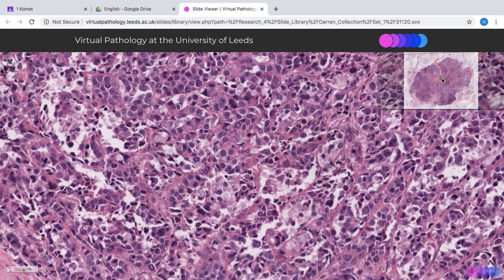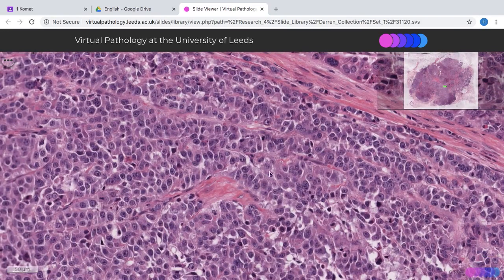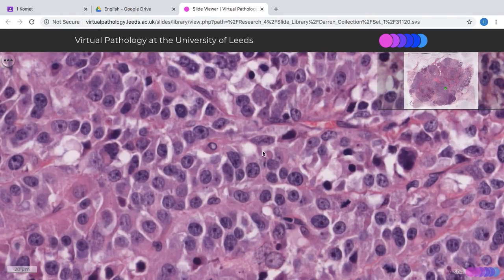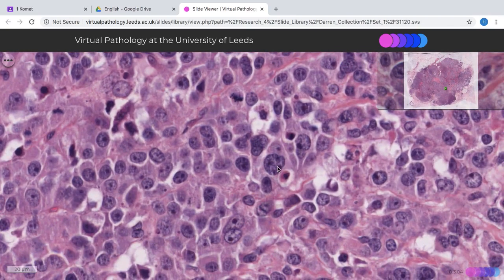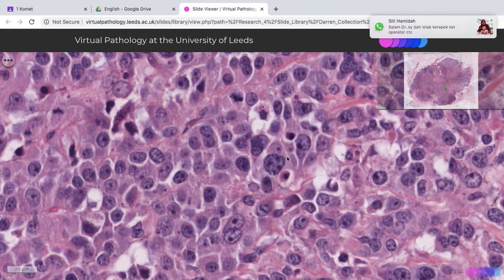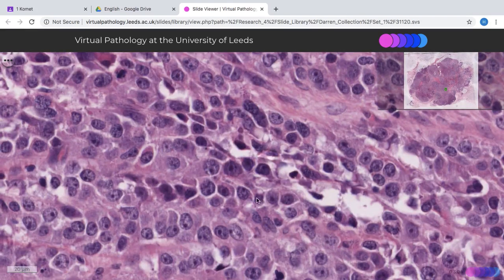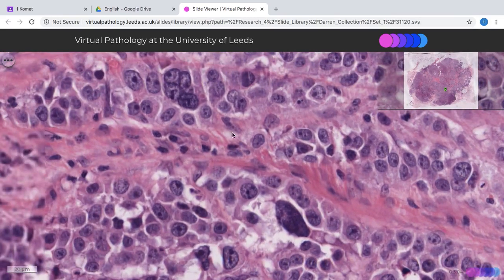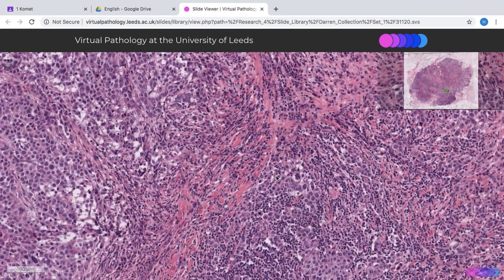Next we look at nuclear pleomorphism — you want to look at the variation in the size and shape of the tumor cells. Overall the tumor nuclei are quite large. For example, here you have a large tumor cell with coarse chromatin and multiple nucleoli, and if you compare it to the tumor cells next to it, this one is probably double or triple the size. So there's quite a lot of variation in size and shape, and you can also appreciate a multi-nucleated cell. In terms of pleomorphism score, you could probably give this a 3 as well.